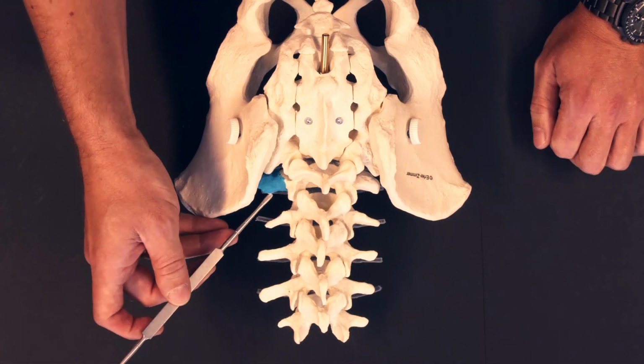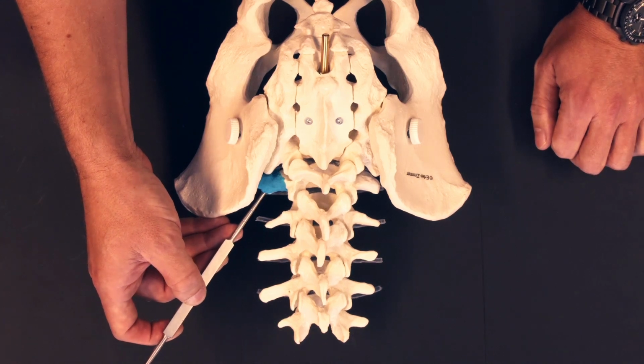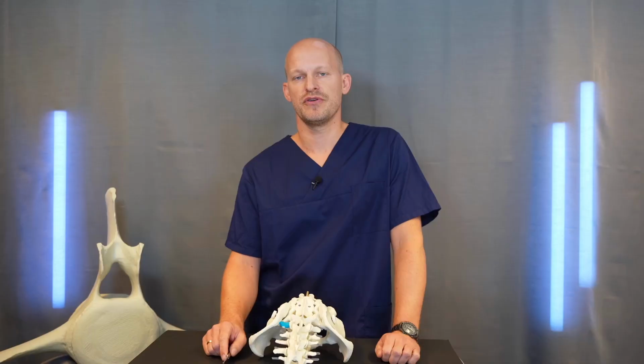While the enlarged transverse process is being severed, the L5 nerve root that runs beneath the transverse process can also be protected with a dissector. By using navigation, the false joint can be identified and removed with great certainty through a minimally invasive access.